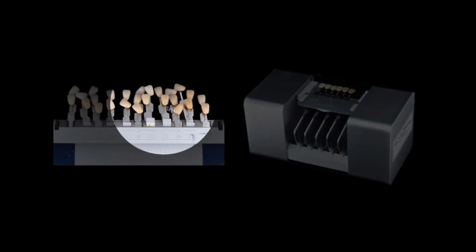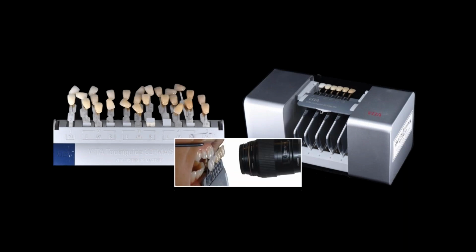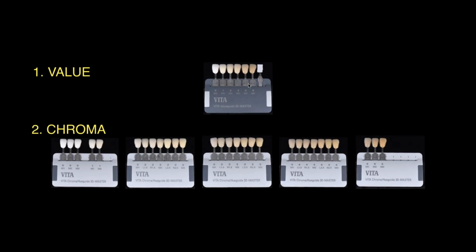The other advantage with the linear guide is it's not as confusing, right? This gets a little confusing when a doctor sees it for the first time, or even a patient for that matter. This is actually a much simpler system, and the way it works is basically 2 steps. First step, what is the basic value, not the chroma? The basic value is nothing more than are we in the 0, 1, 2, 3, 4, or 5 range.